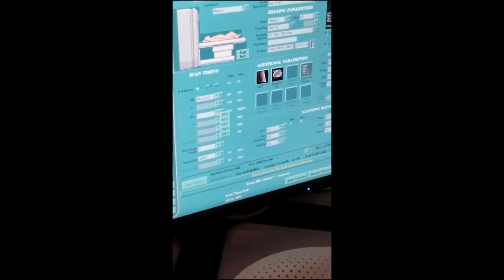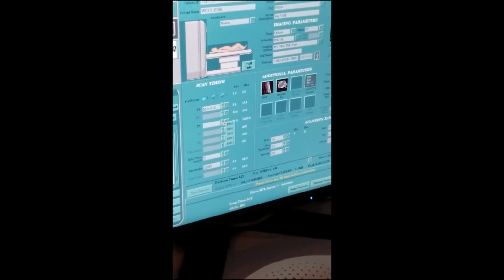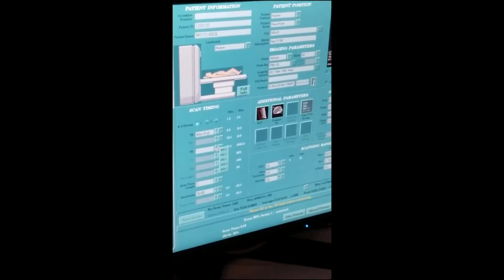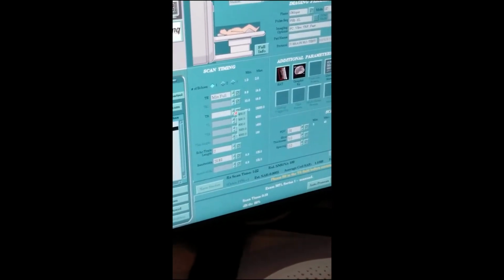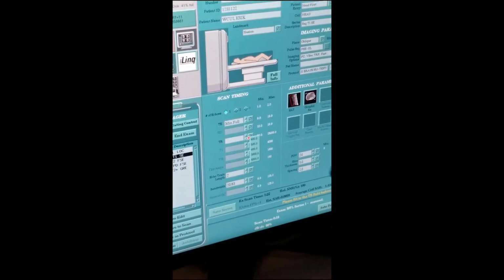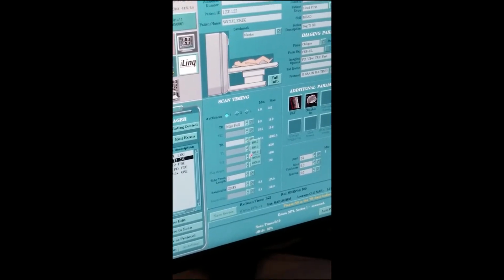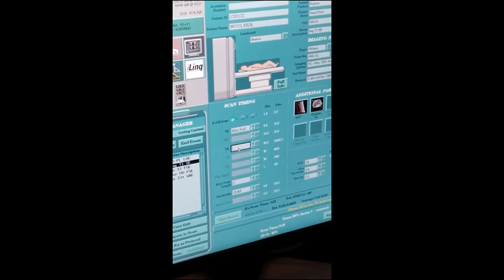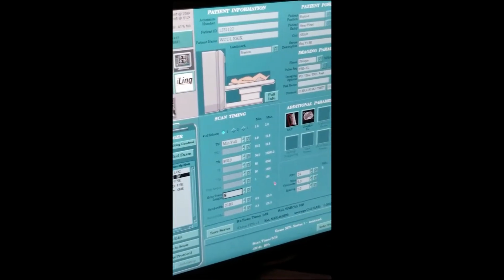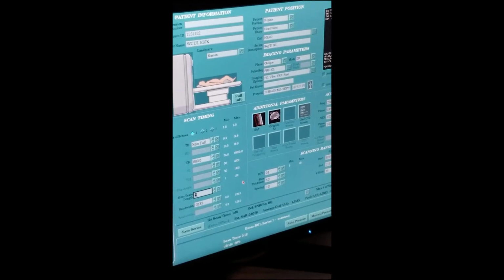So now TE was short. What about TR? TR short. We said from what to what? Under 800, 800 or less. I don't know what you need, because how many slices do you need? 23. Right now it's only giving you 14. So put 800. We know we need 800. You can type 800. See what happens. Now it's giving you 28, so you can reduce it.